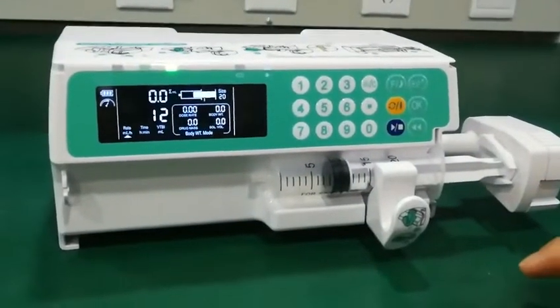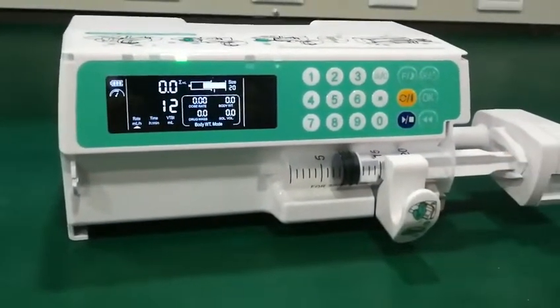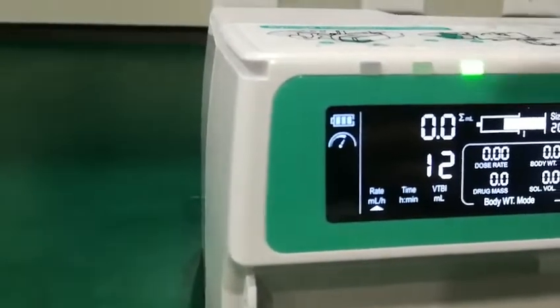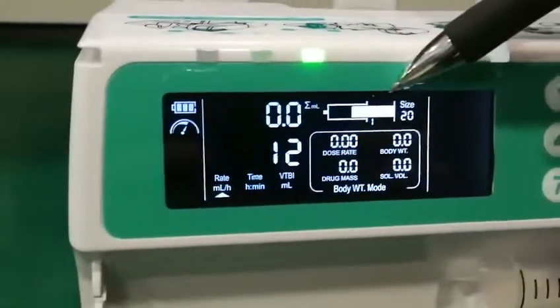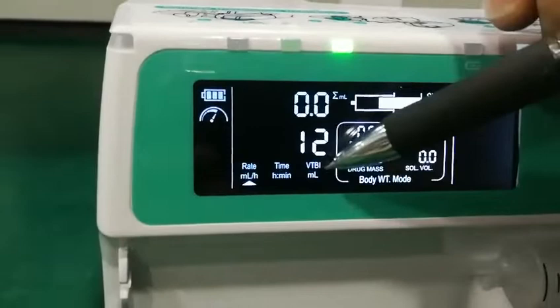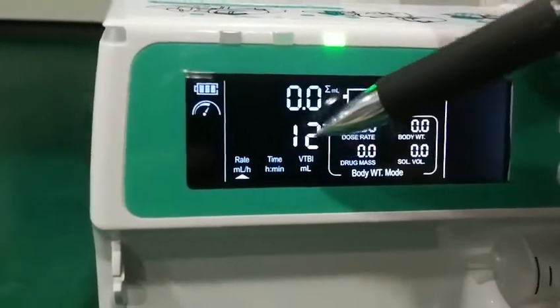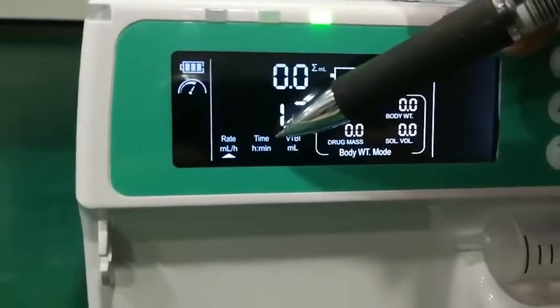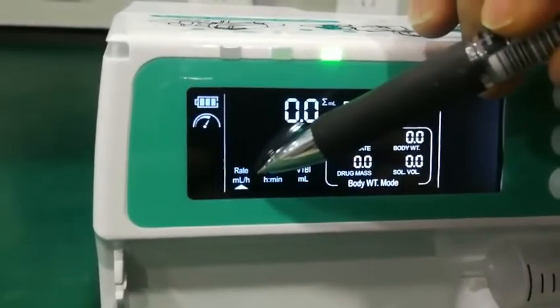Now I introduce the screen of the machine. Here is the occlusion level, here is the battery, here is the syringe size, and here is the total volume infused. Here is VTBI — volume to be infused — and here is the time of infusion. Here is the flow rate of the infusion.